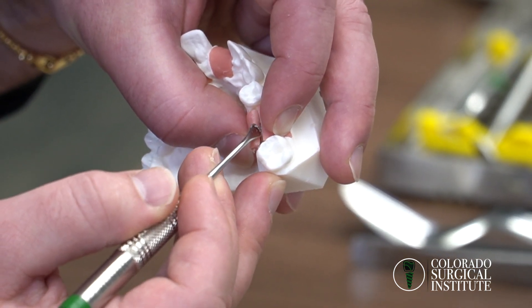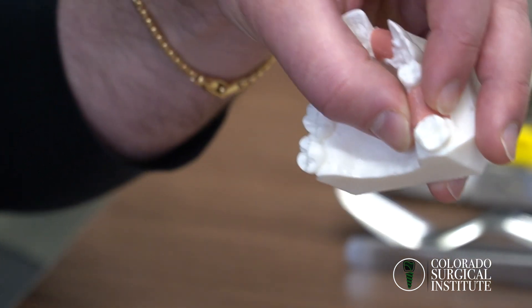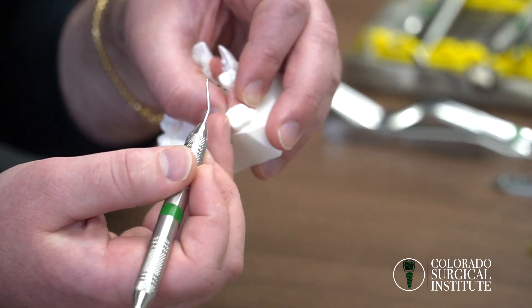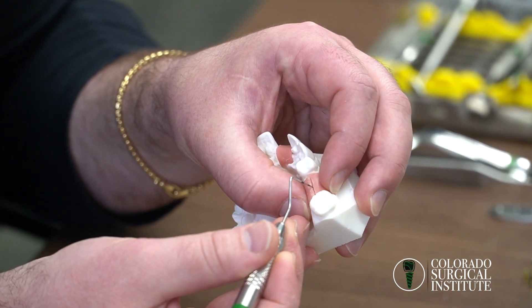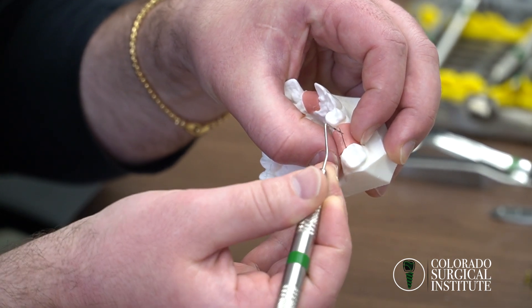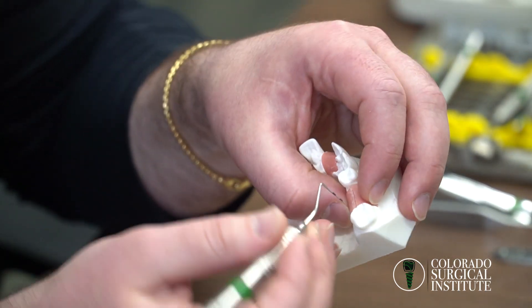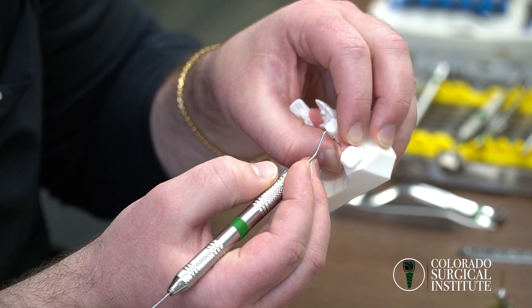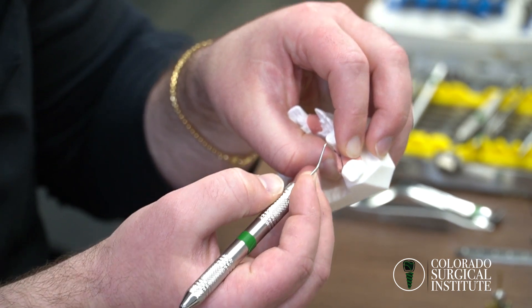If you make a mid-crestal incision, about half of the tissue will cover the top of the implant. When you go to suture, the middle of the incision will be over the middle of the implant. Early in surgical careers, suturing isn't always perfect, and after inflammation subsides it can leave a small opening. You don't want that opening to be right over the implant, because bacteria can cause peri-implantitis and bone loss before the implant even heals.